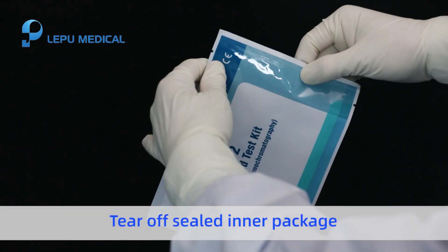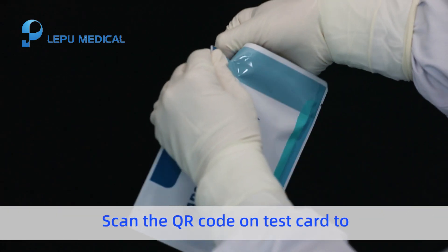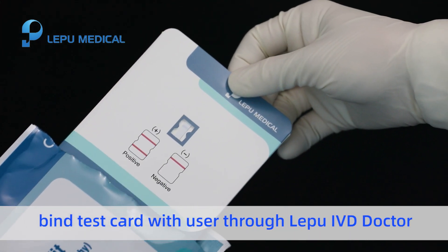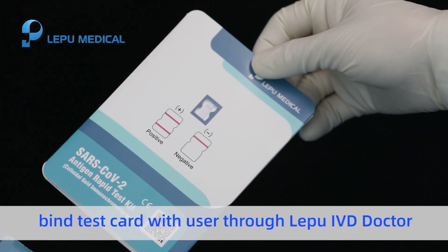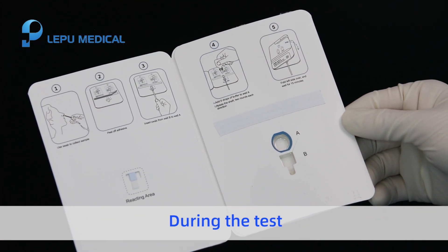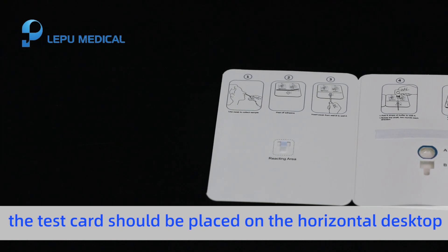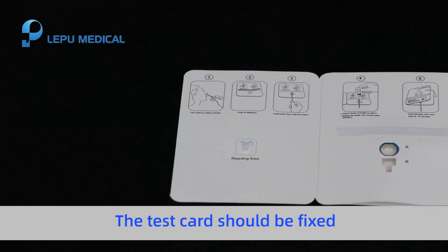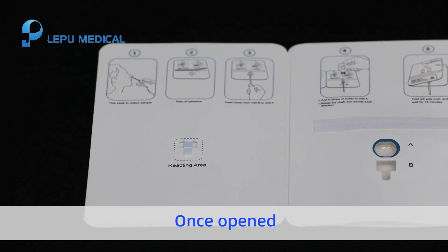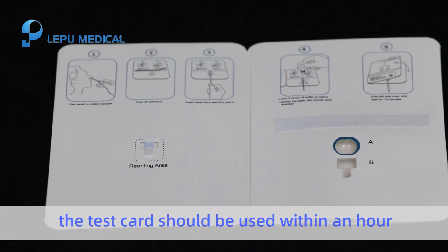Tear open the sealed package and take out the test card. Scan the QR code on the test card to link the test card with the user through Lopu IVD Doctor. Place the test card flat on a clean platform. During the test, the test card should be placed on a horizontal desktop, kept fixed, and not removed. Once opened, the test card should be used within one hour.